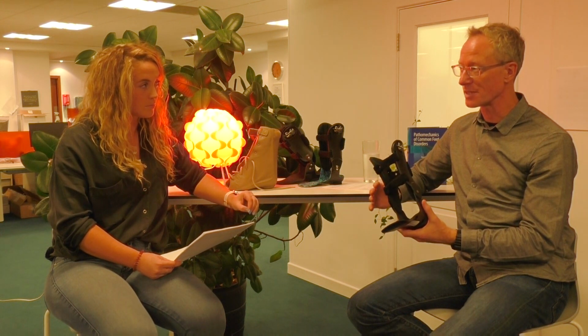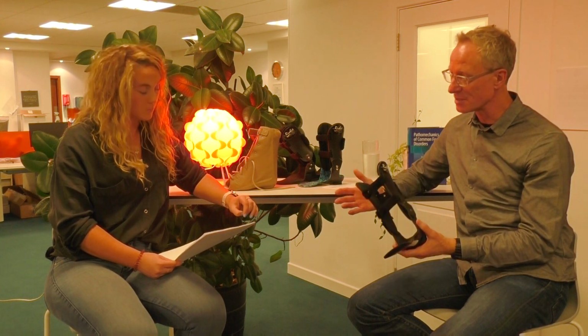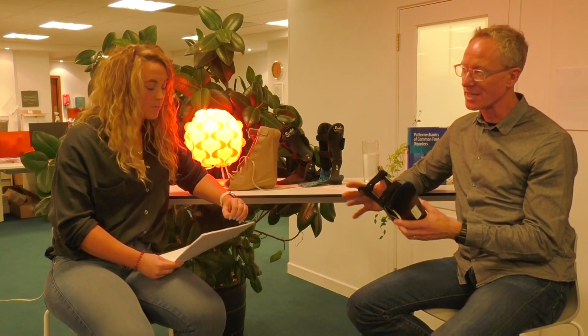Okay, well an AFO, as the name suggests, ankle foot orthotic, essentially increases our ability to treat conditions of the ankle and the lower leg. So within that context, we can aid ambulation, so we can try and improve movement, or we can actually limit movement, so we can use it as a splint. In some pathologies such as drop foot, we can aid ground clearance and ambulation. So they would be the key reasons to use an AFO.